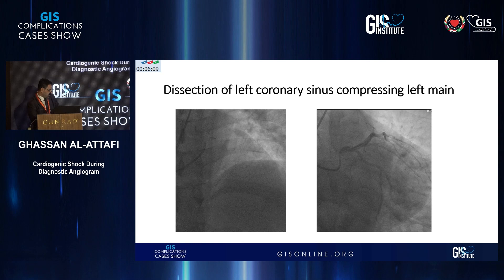If I see it correctly, the image on the right shows the dissection has extended into the LAD. That's a significant dissection — it will be difficult to leave alone. If it were very limited to the left main and the patient was stable with normal flow, you could consider conservative management. But with extension into the LAD, it would be difficult to leave it.